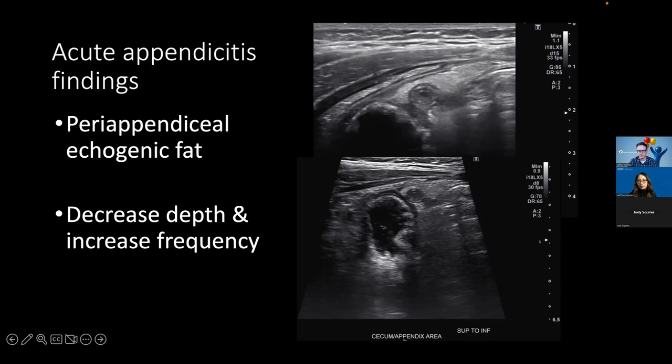Also, just to note, the focal point is not where the main abnormality is. I feel like on some machines there may be a little more tweaking, so you just have to be conscientious of what machines or probes you're using, especially at institutions with multiple different types of fleets. That can be a little challenging. Of course, in the chat I would love to hear your experience. And actually, Jeffrey and Judy, what probes or machines do you have, and is it sometimes hard to get the fat to stand out?